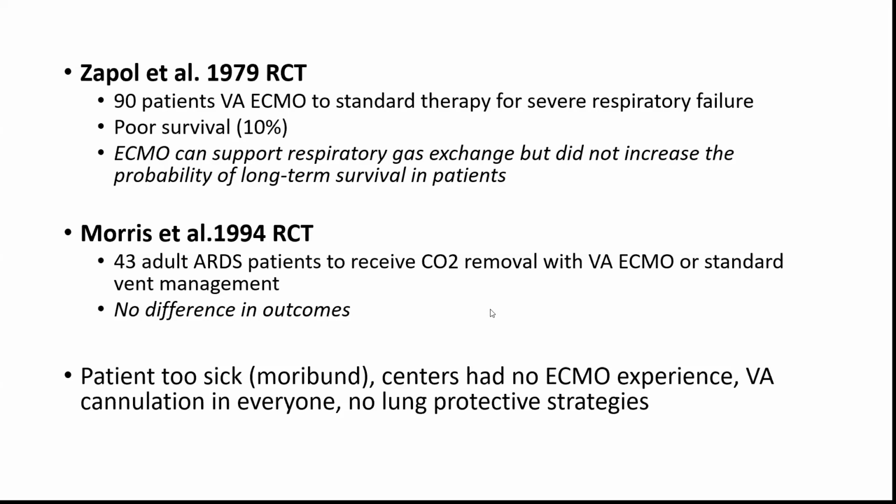I mean, this was a randomized controlled trial, even though it was 90 patients. Until Dr. Morris came in 1994, and he conducted another randomized controlled trial looking at a slightly different aspect of ECMO. So you know you can use ECMO for oxygenation, but he actually looked at it for CO2 removal in refractory hypercarbic patients. And again, he had 43 patients, and he randomized them to either CO2 removal or standard of care. And ECMO was actually effective at removing CO2, but there was no difference ultimately in the outcomes, which are looking at mortality. So after that, there was actually a downslope in the use of ECMO. Between the 1990s and the early 2000s, which we'll talk about, ECMO use was not a popular thing. It was not a popular management modality.